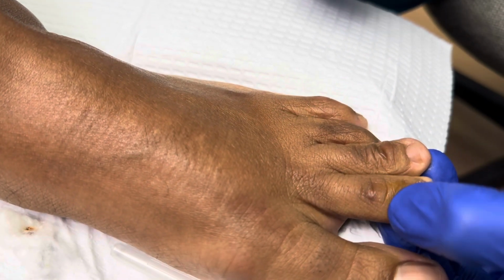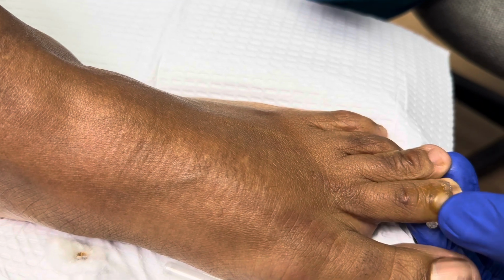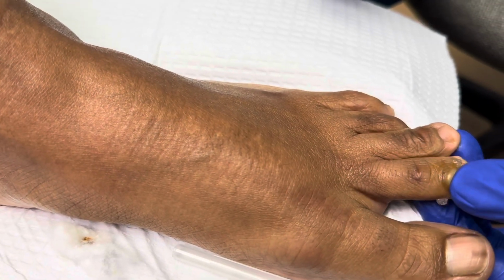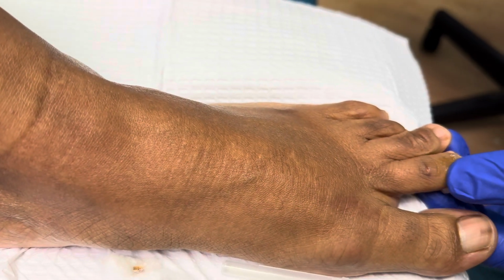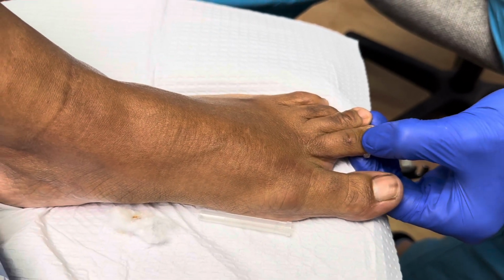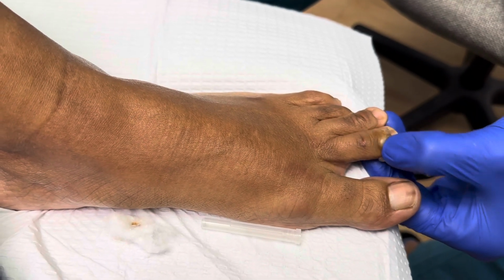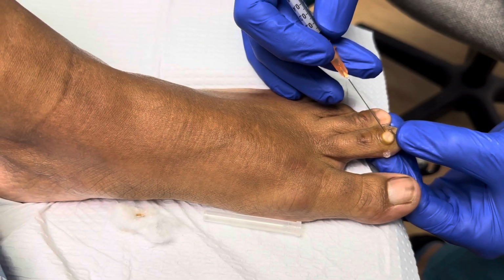Now, if we were looking longer term at this, then what we could potentially do is remove the knuckle of the bone. Right now our patient's traveling, so it's not an optimum time, so we're just going to make this more comfortable, and it might be 2 months, it might be 6 months, it might be 2 weeks when some recurrence of this cyst will come back, but we're going to drain it to the best of our ability.